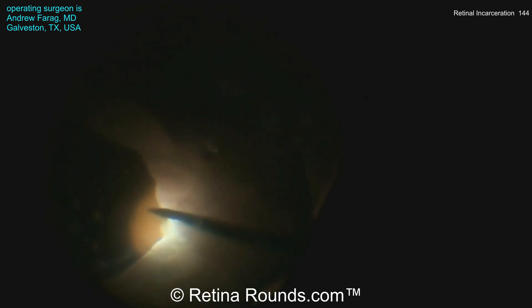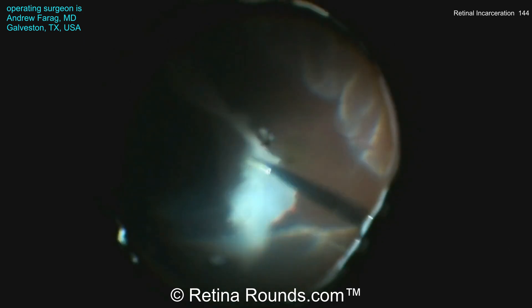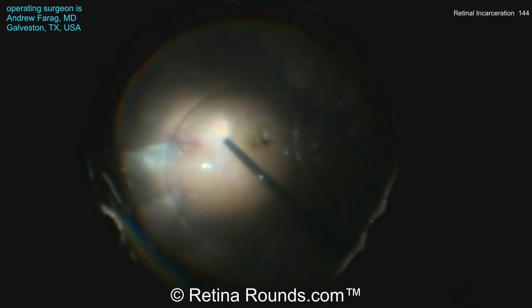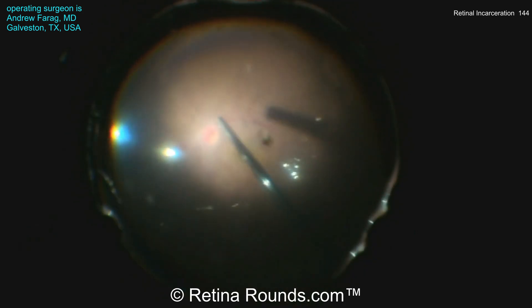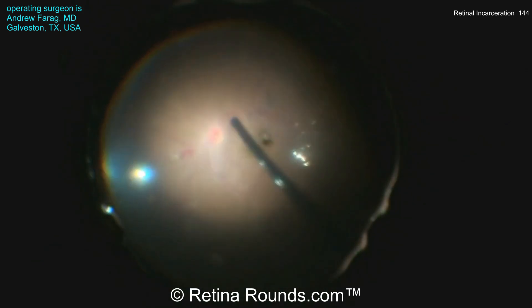Dr. Farag takes down the PFL and inspects the subretinal space, using forceps in the right hand and the light pipe in the left. He identifies subretinal membranes contributing to the persistent retinal folds. Using a nice posterior-to-anterior peeling approach — grabbing the membrane at its most posterior extent and stripping it anteriorly — he removes as much as possible. PFL is then reintroduced, and the retina is completely attached; the folds in the supranasal quadrant have resolved.